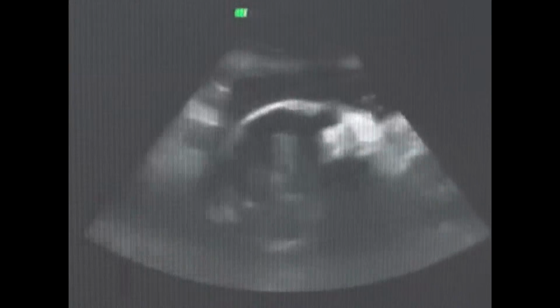So it's not an unexpected thing. But I'll go look in 2D. It's easier to see in 2D on the back of her head, which is over here. So I'll look at that in a few minutes. I just really want her to move that. It's just right on top of her lid. So you want me to try to move it? I'm going to try to push on her for a minute before you do that.